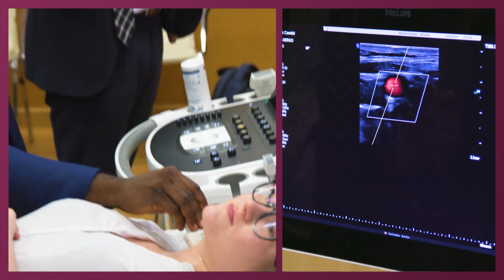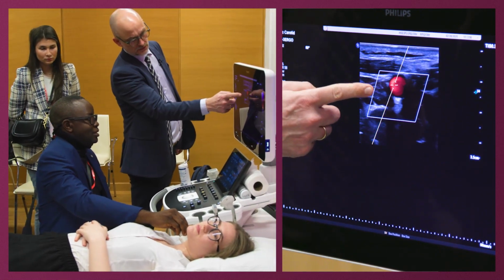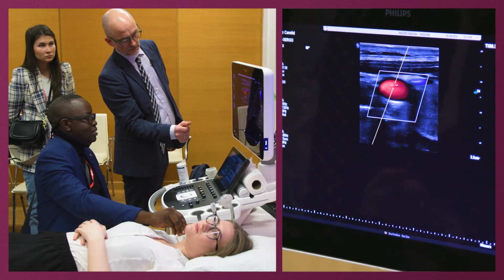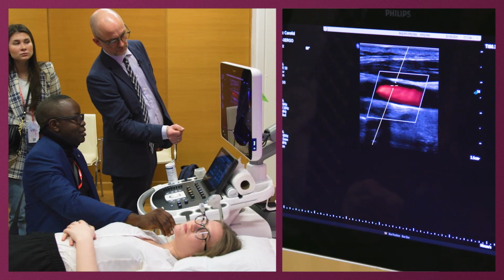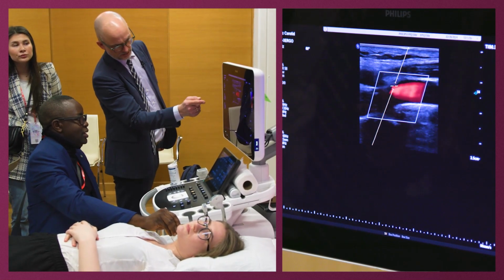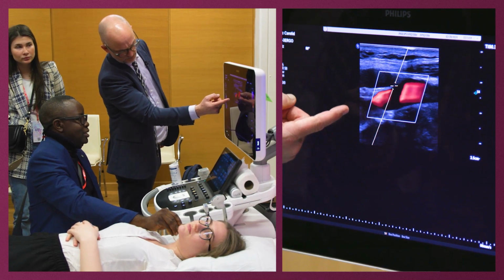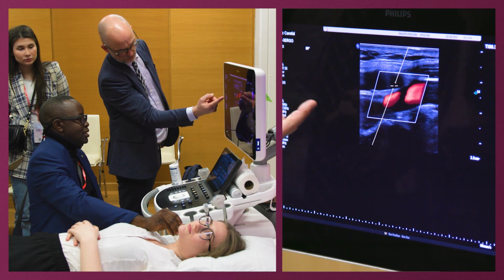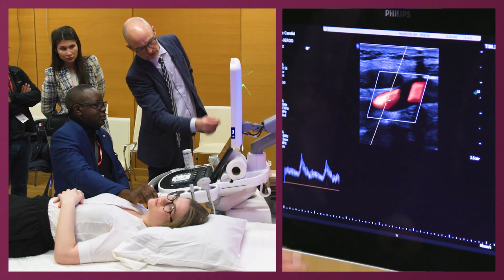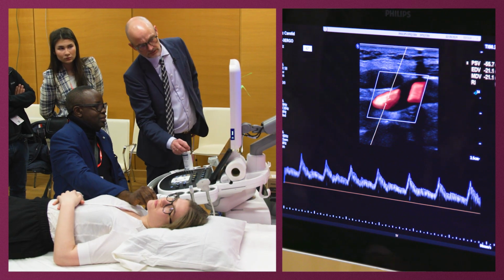And then you should, in one image, try to visualize the internal, and in another image, the external. It's not easy. This is a cross-sectional view. It's too much. Exactly, you have something going down here, and you have maybe something here. I'm not satisfied with the angle. This is better. What do you think?